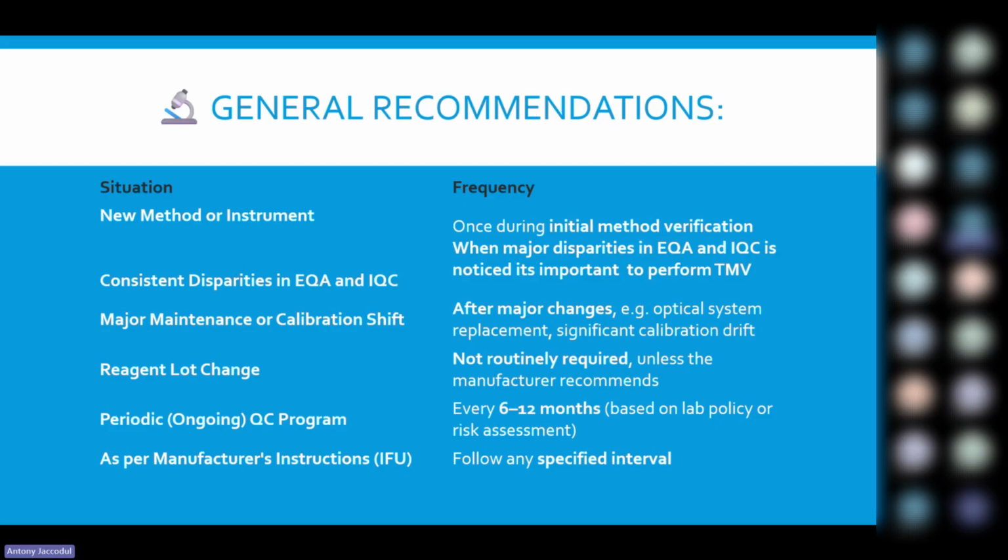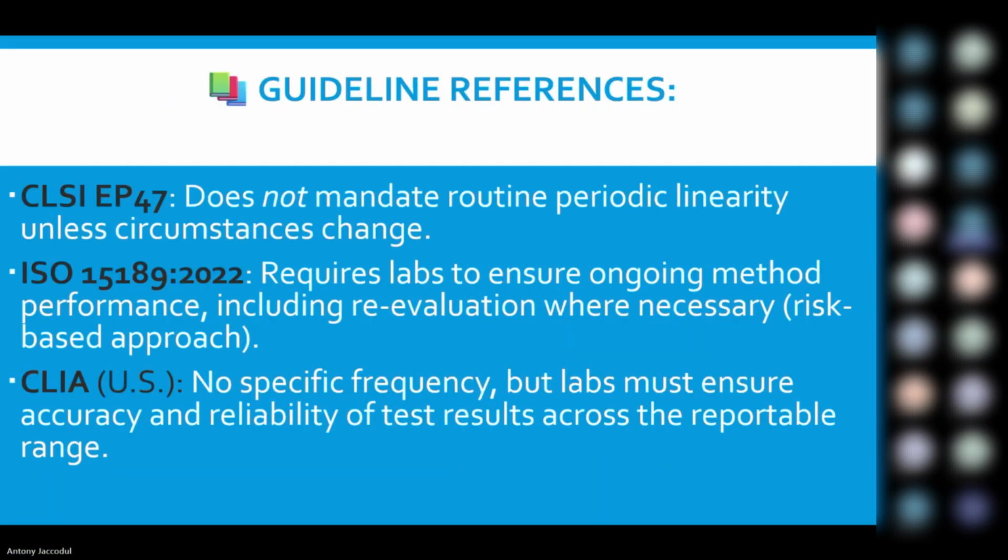Or if the manufacturer makes a recommendation, you also need to take that into consideration, because most of the time most lab scientists don't really read the manufacturer's recommendations. You can also say every 6 to 12 months, as per your lab policy, as per the risk assessment, or as instructed by the manufacturers.